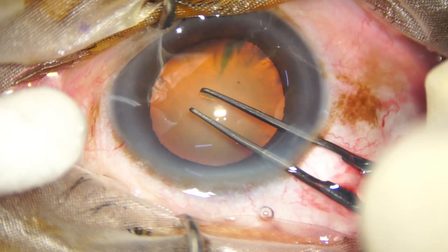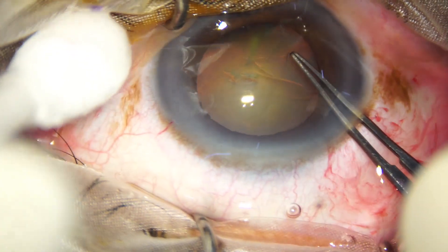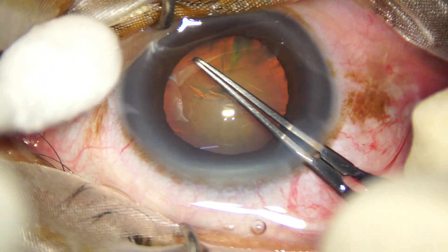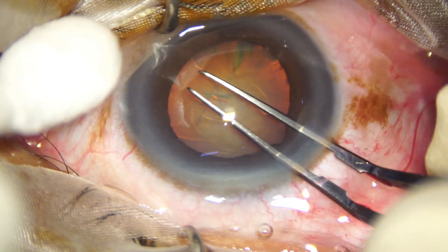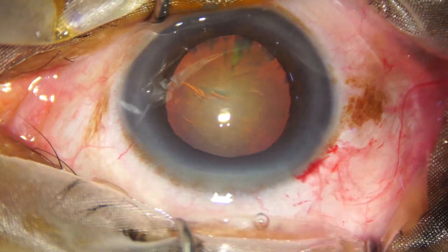With the help of a utrata forceps, an adequate sized rhexis is done. The size of this rhexis is about 5.25 mm.